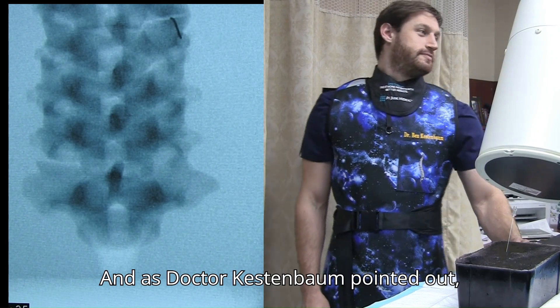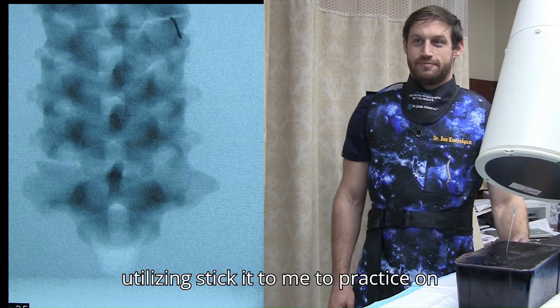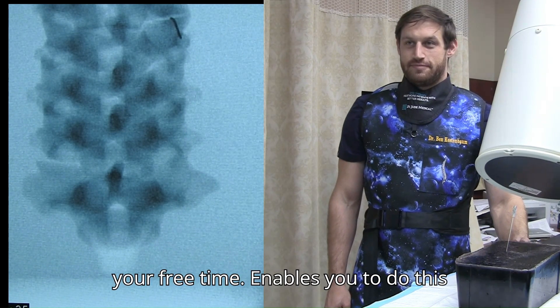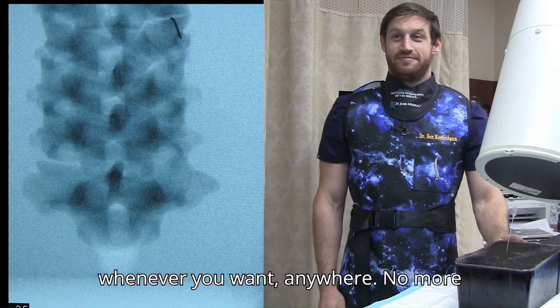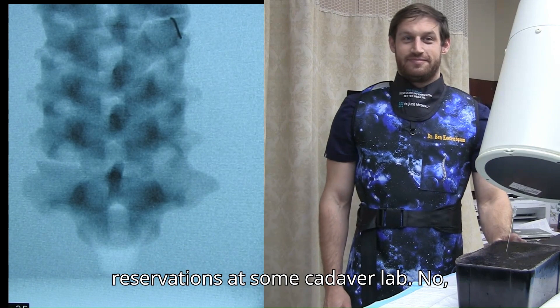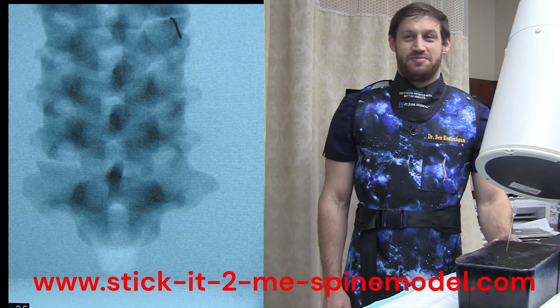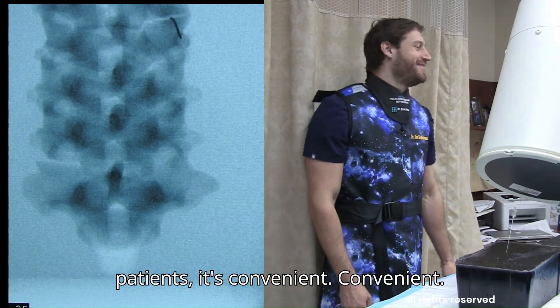And as Dr. Kestenbaum pointed out, it's just a matter of practice, and utilizing Stick-It-To-Me to practice on your free time enables you to do this whenever you want, anywhere. No more reservations at some cadaver lab. Between patients, after patients — it's convenient.